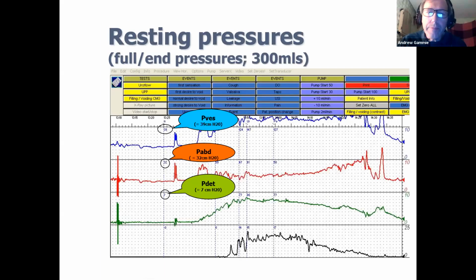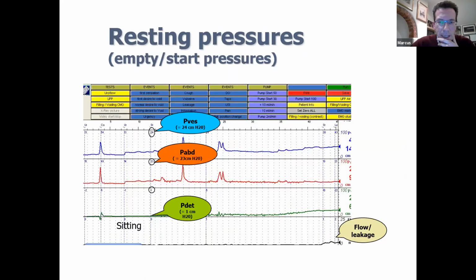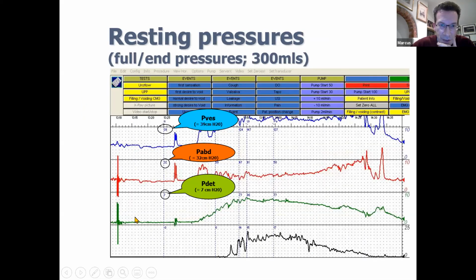Okay, so we're talking about the compliance of this trace. Here you've got a detrusor resting pressure of 1. Here you've got detrusor overactivity. This is settled by the time you come towards the end of the trace. You've done an entire load of filling, which isn't displayed on this trace. So when you come to the end of the trace, I would describe this as looking flat. It's not overactive, and so this is actually a pretty unremarkable resting detrusor pressure at this stage.